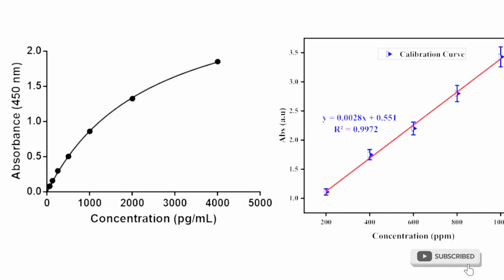So I want you to also see that linearity, even though it can signify a straight-line curve, if you look at this one, it is not really straight. It's maybe something like a hyperbola, I would say. But for the fact that these points are within the targeted range, that is still linearity.